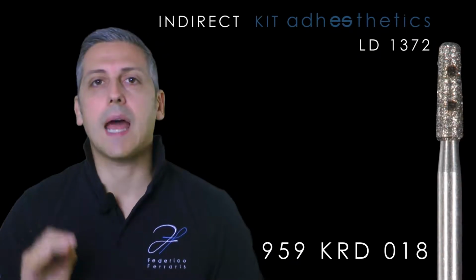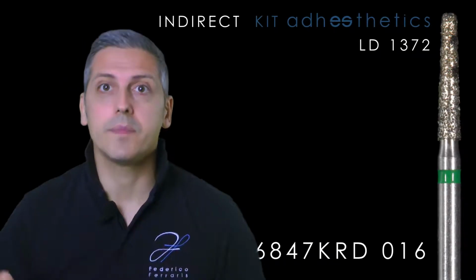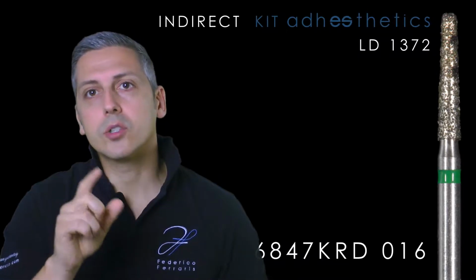The first one is the 959 KRD 018, and the second one is the 6847 KRD 016. Both are 314. 314 means friction grip attachments, so you can use them with a turbine handpiece or with a red ring handpiece. I prefer, and I suggest to you as always, to use the second one, the red ring handpiece, to have the possibility to increase or decrease the speed depending on your purpose, considering what you want to achieve during that phase.